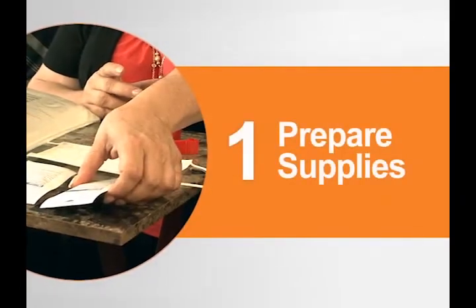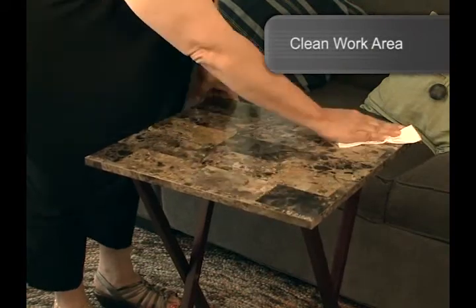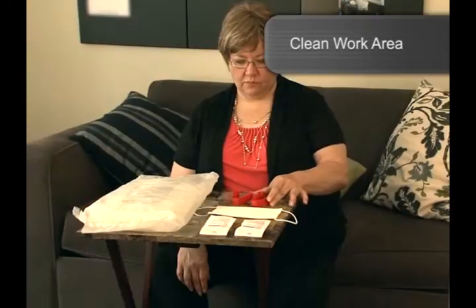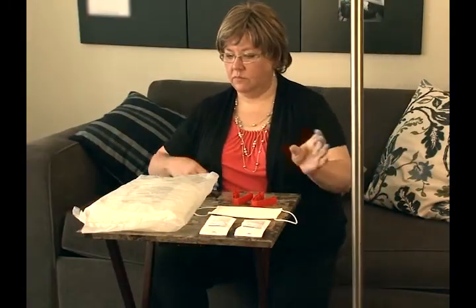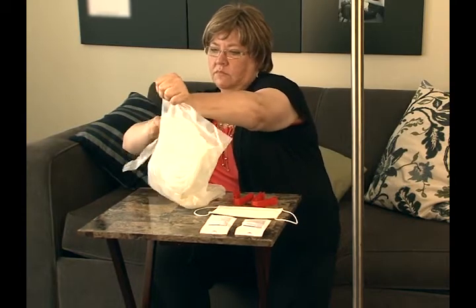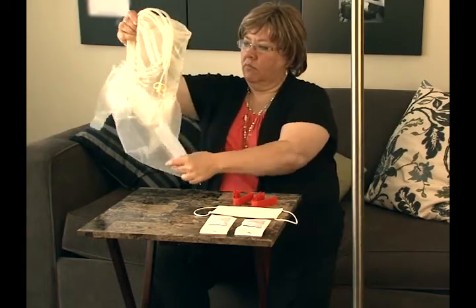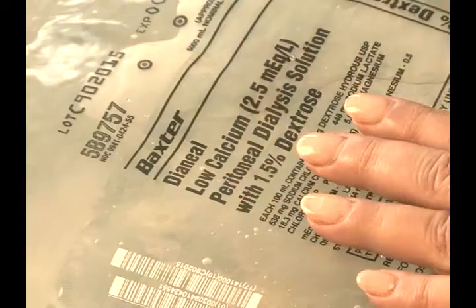Let's see how to perform an exchange using the UltraBag system. Before you begin, it's important to be sure you are using the UltraBag system in a clean and uncluttered work area. You will need an IV pole or something similar on which to hang the solution bag. Place the UltraBag system, two UltraClamp tubing clamps, and the new MiniCap disconnect cap within easy reach. Remove the UltraBag system from the over pouch and place it on your work surface.